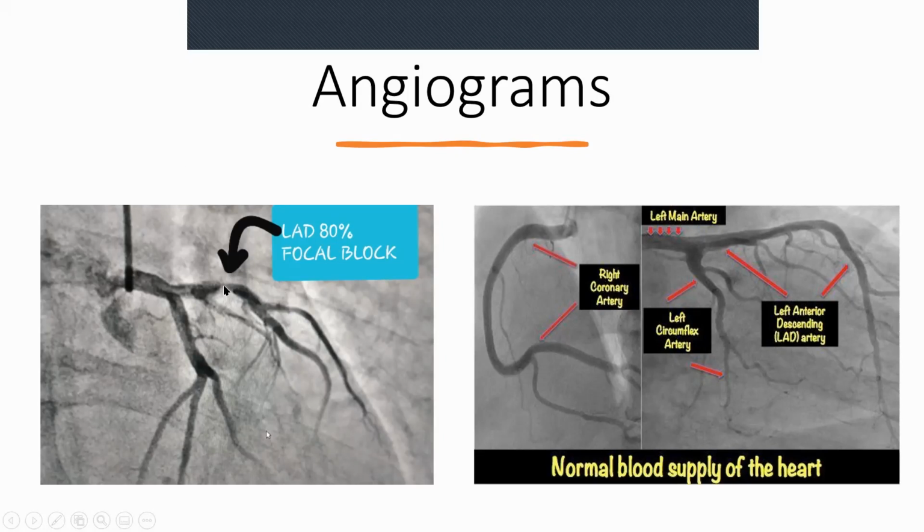Now, I must be honest, I haven't sat in enough to be able to tell you exactly how they work out the percentages precisely, how they work out a 60 compared to a 65 and things like that. And if anybody does know, I'd love to know myself. But I think they basically just look at the amount of flow and things like that, and it gives them quite a good idea of what's going on.